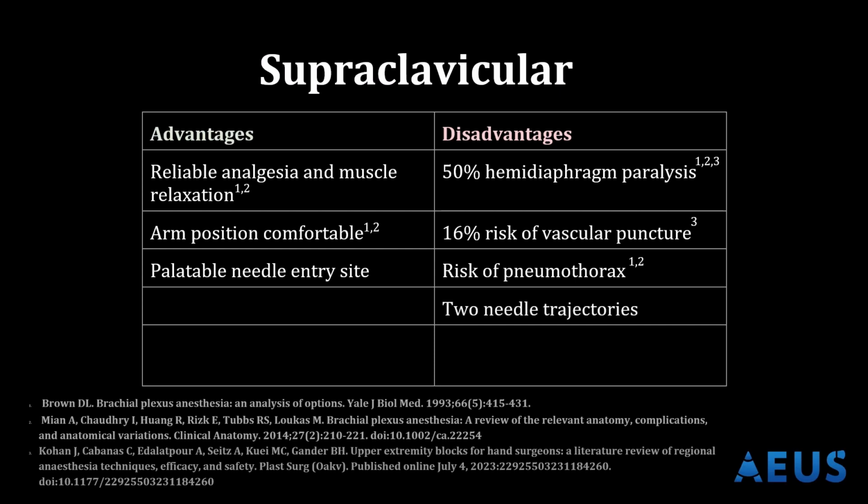This block also requires repositioning of the needle, which is 2 needle trajectories to follow. And you may require some supplemental block of the skin of the shoulder, depending on what injury exactly you're working on and what was the mechanism.